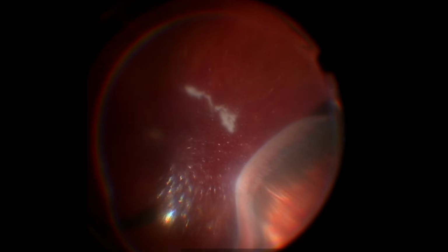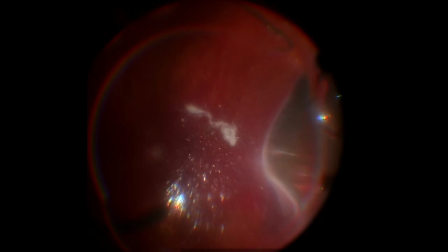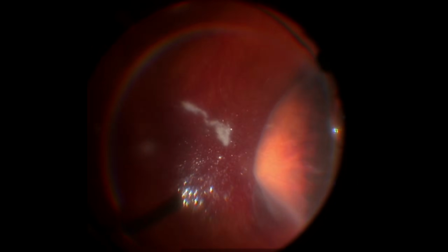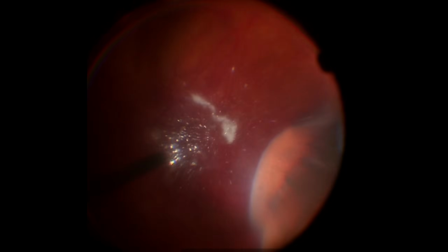After that, we performed 360 degrees of scleral depression, going clock hour by clock hour. Pay attention to the technique here, rolling the depressor from the ora serrata posteriorly and watching carefully for the break to open up. Even with a very thorough search, we still couldn't identify a retinal break. So we moved on to a peripheral vitrectomy with shaving of the vitreous base to release any potential traction.